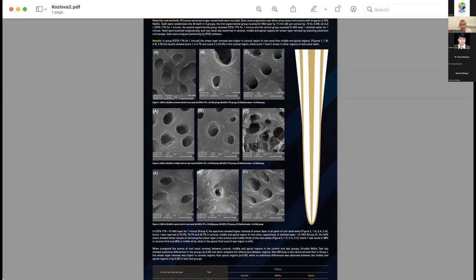So I think you are similar somehow with this procedure. So that's why this is also a challenge for us to make it stable for a long way. That's why, until our days, there are a lot of investigations on how to do it. And lasers in modern dentistry actually show really great results.